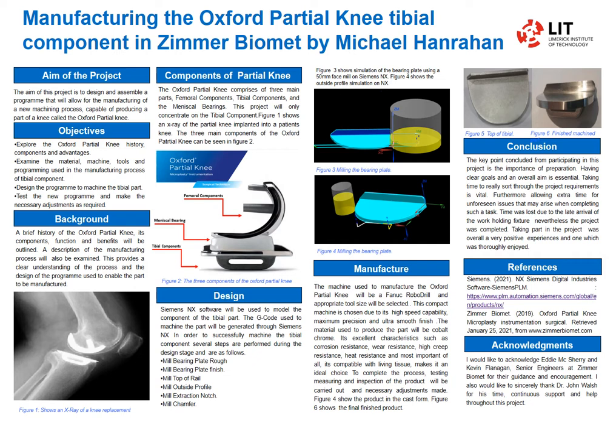The objectives are to look at the history, the material, tooling, the machining, and the main one is to design the program that will actually manufacture the part.